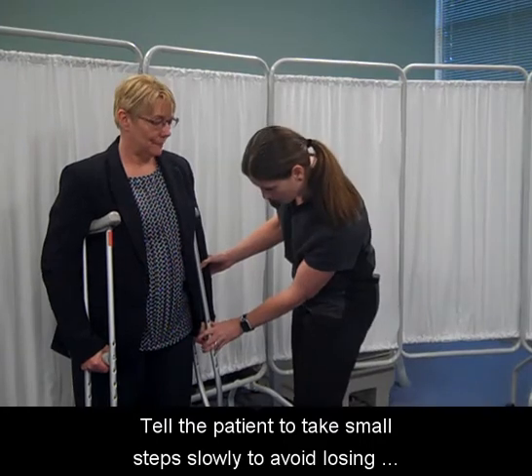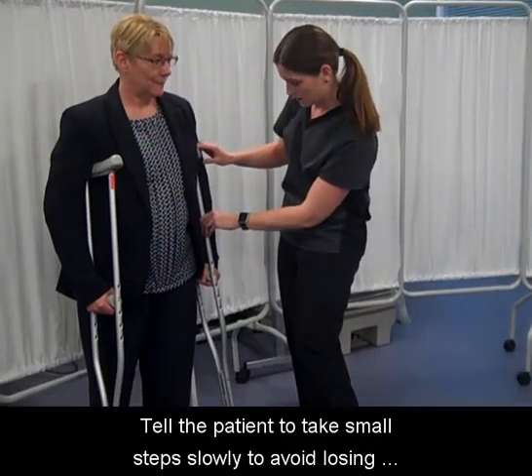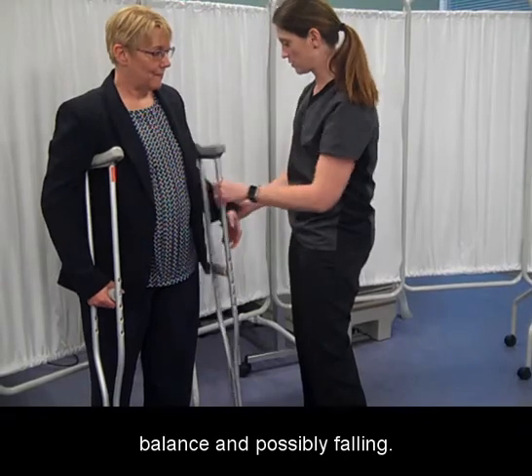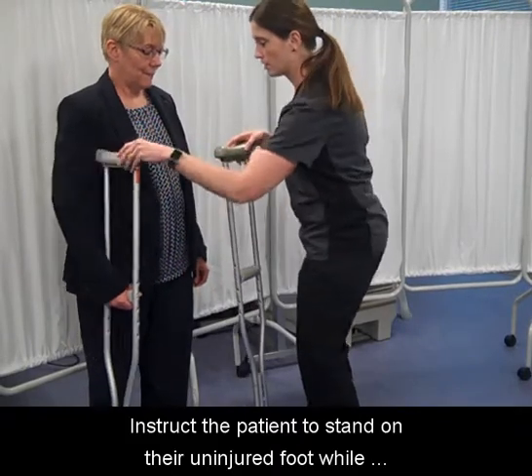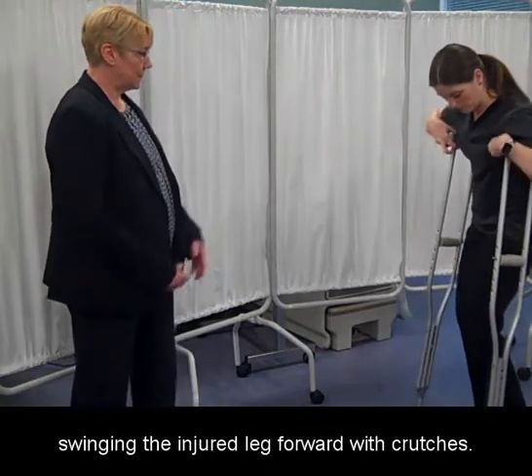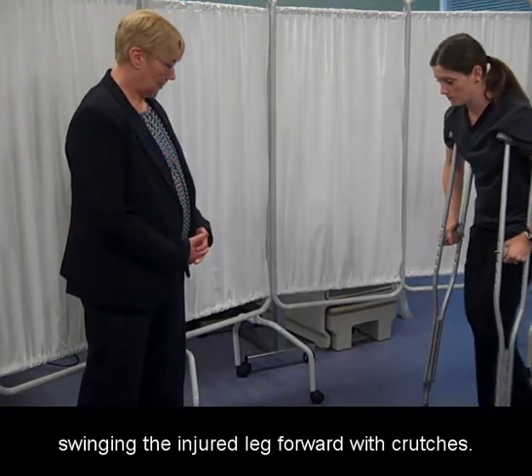Tell the patient to take small steps slowly to avoid losing balance and possibly falling. Instruct the patient to stand on their uninjured foot while swinging the injured leg forward with crutches.